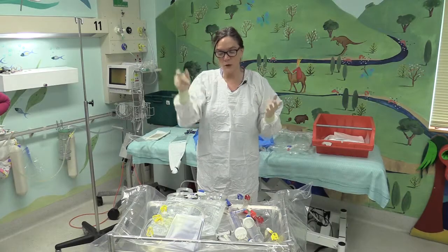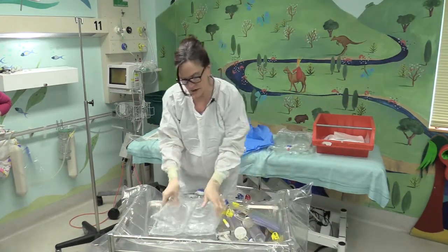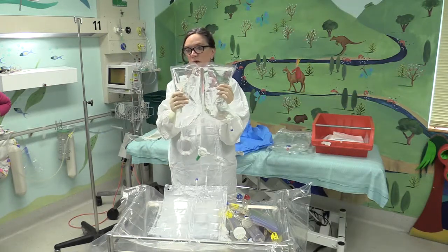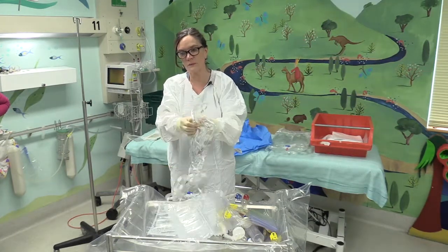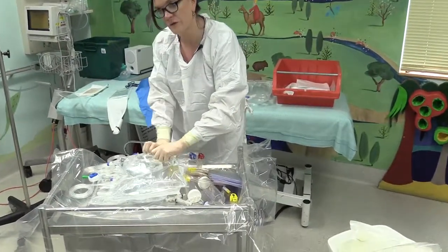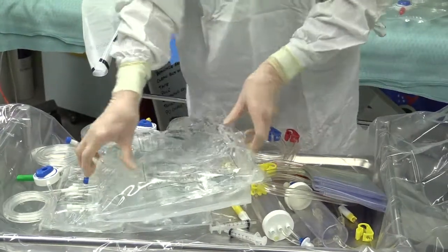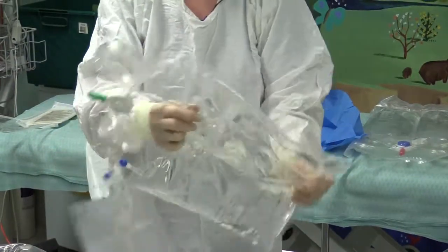I'm going to start by organising my equipment, and I have to prepare the bag because the bag is sealed down the middle. So 2 compartments. One with the glucose and one with the electrolytes. So I need to break that seal. That can be done by pulling it apart or rolling it. I prefer to roll it from the corner, and the pressure will burst the seal. Keep rolling and just gently turn the bag to mix the solutions together.